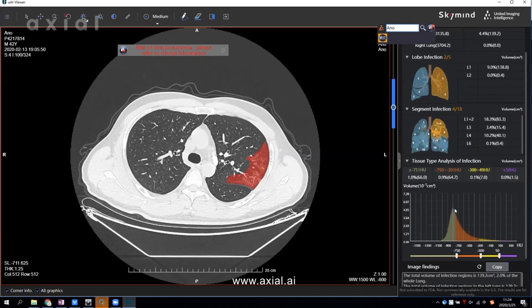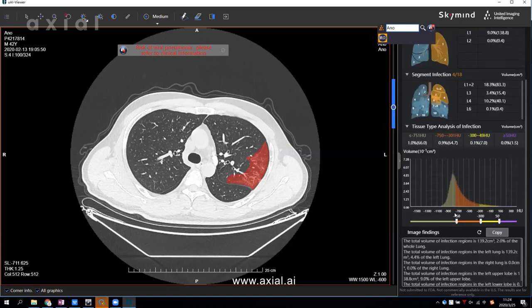At the final part, Axial AI will provide a summary of the image analysis report. You can copy and paste it into your own notes.